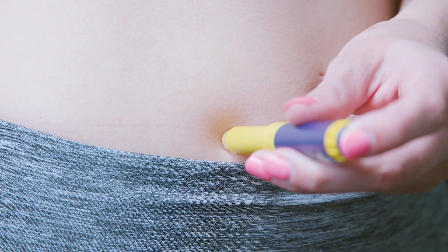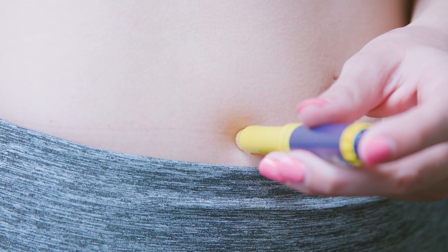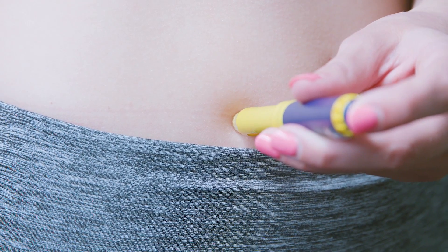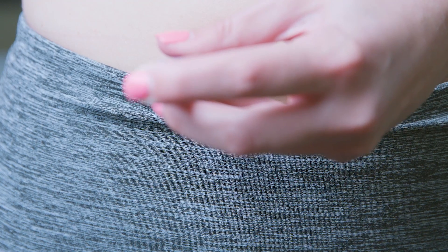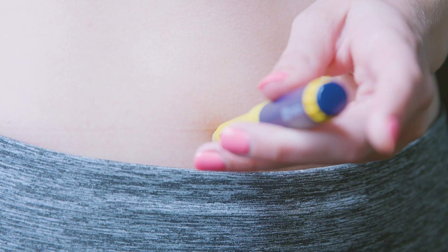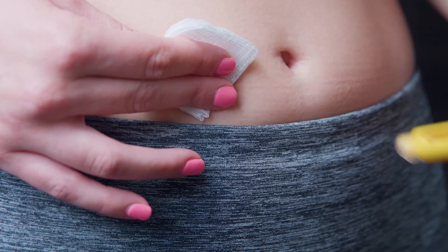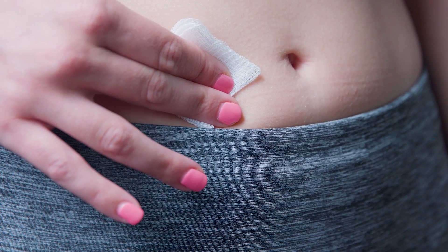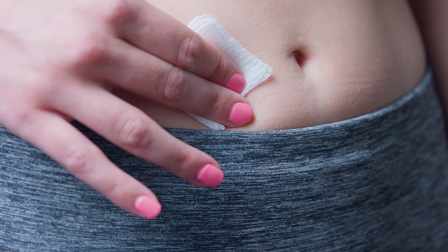Pinch a fold of skin between your fingers at the injection site. Insert the needle in its entirety and press the dosage knob until all of the medication prescribed is administered. Wait five seconds with the needle inserted prior to removing. Once the needle pen is removed, apply pressure to the injection site with a gauze pad. A band-aid may be applied if needed.